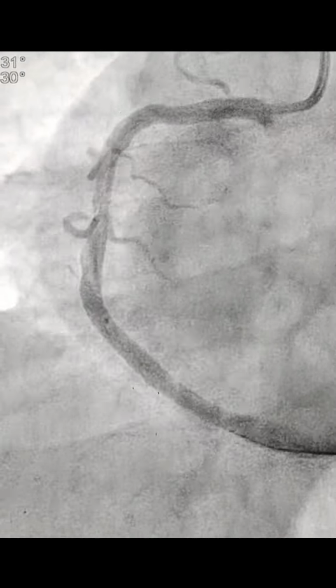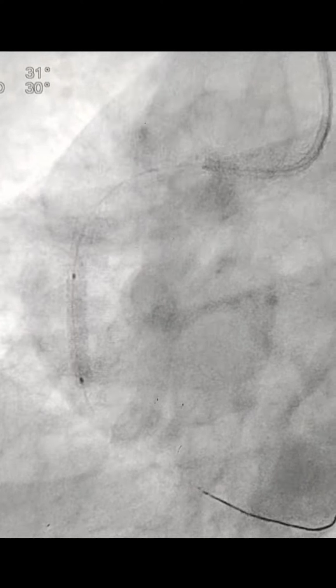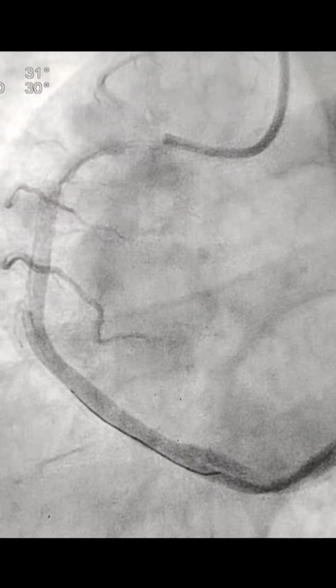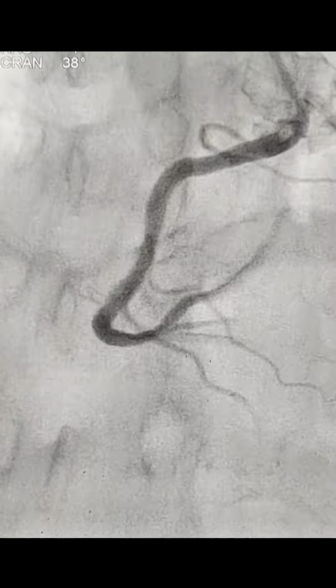We took a stent boost for the overlapping. There's a stent boost, and we overlapped the stent, and this was the positioning of the stent, and then deployed the stent. And this was the overlapping. We had done overlapped, and this was the scene after the stent deployment, second stent deployment. So this is the scene after the stent deployment.